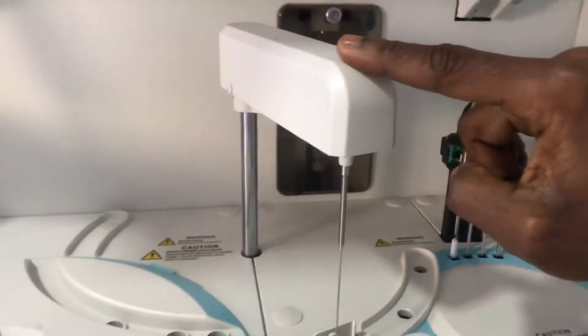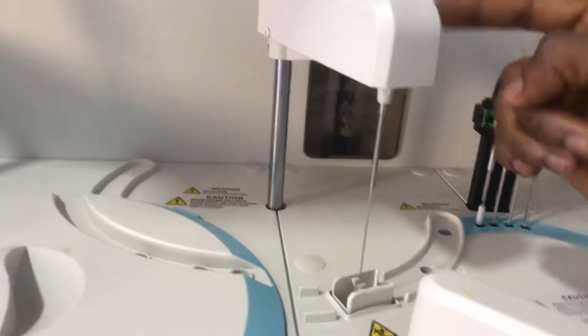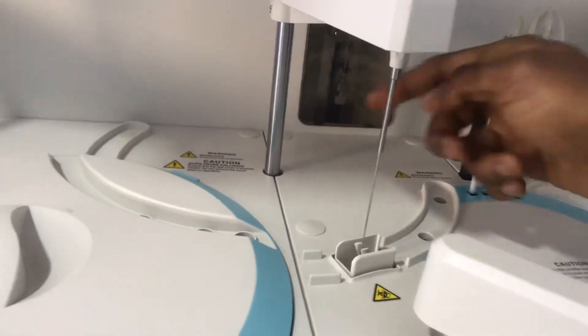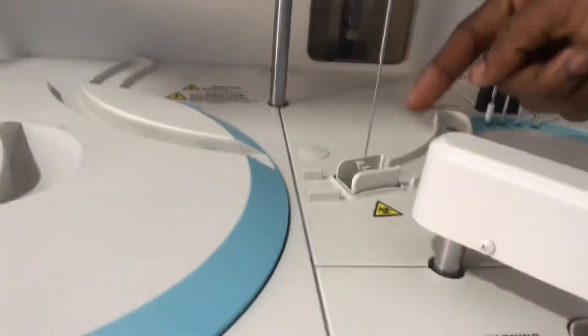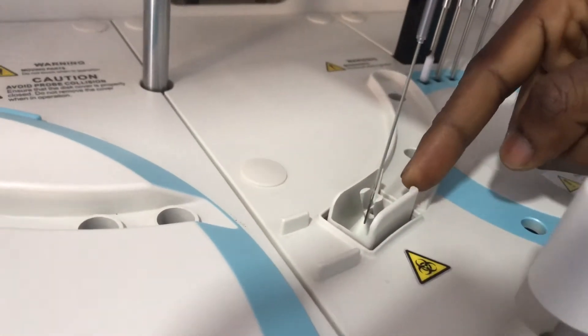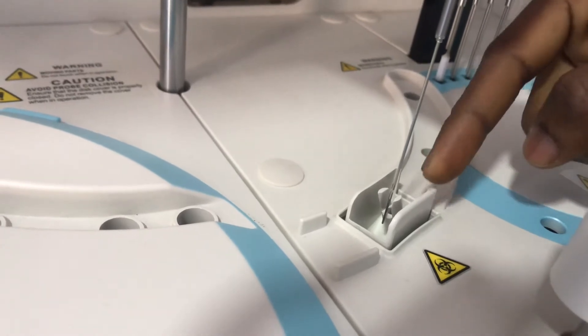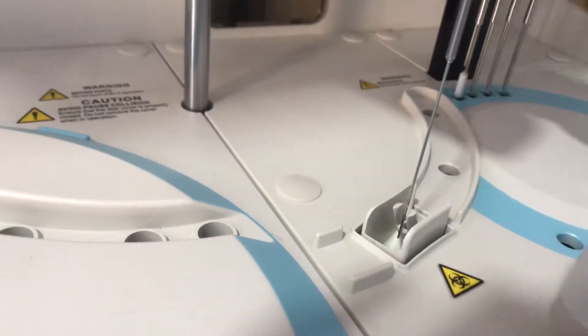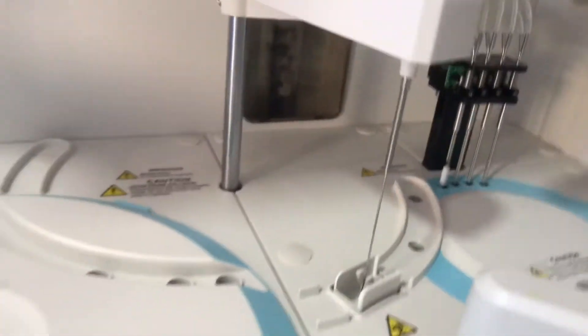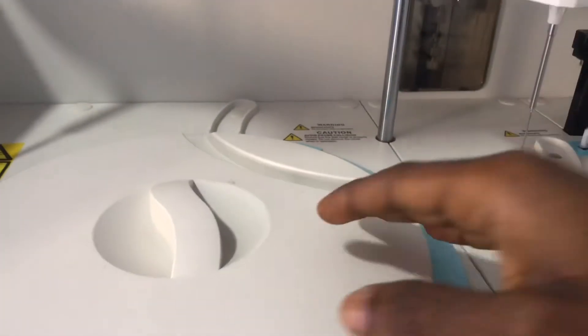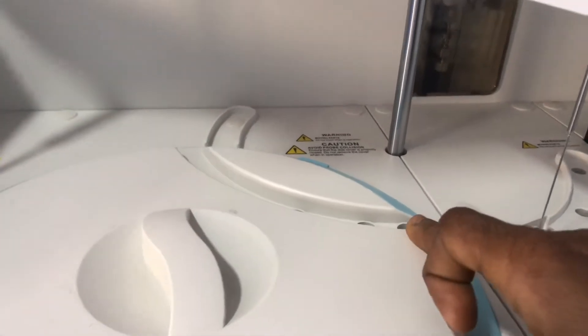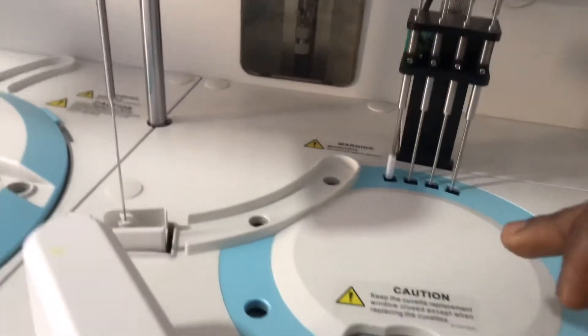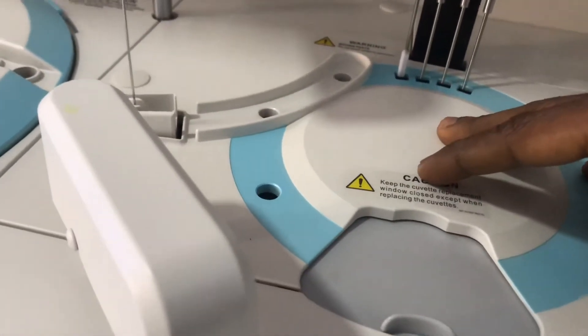Now let's focus on the dispenser assembly. This is basically the dispenser assembly—this is the arm, this is the probe, and this is the rotor. In here we have a wash well. What the wash well does is it washes the interior and exterior of the probe. Basically, what the probe does is it picks the sample and the reagent and then moves them to the reaction carousel where you have the cuvette to allow the reaction to occur.